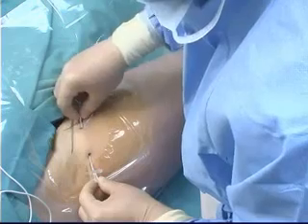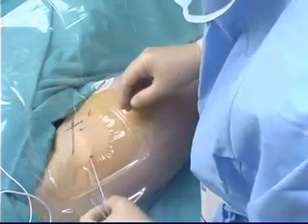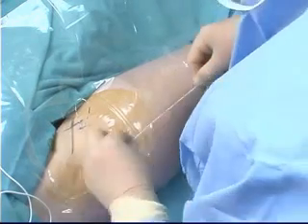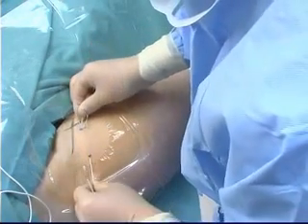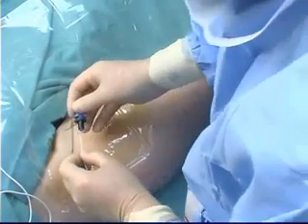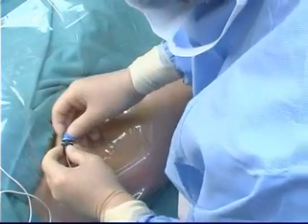needle removed. The piece of silicone tubing that protected the catheter tip while packaged is handy to place in the loop made by the catheter to protect the skin under the skin bridge. The snap lock is attached to the proximal end of the catheter.